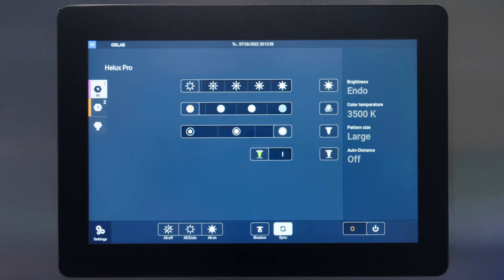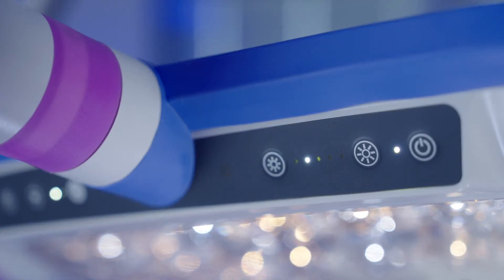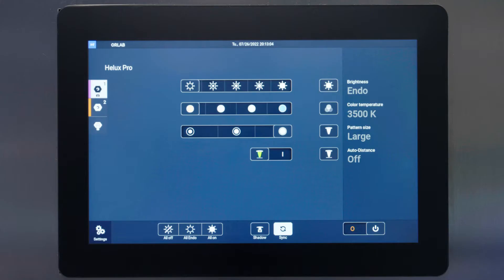Select the preferred brightness level on the wall control or via the control on the side of the light head. The light intensity can be set separately for each light head by turning off sync on the wall control.